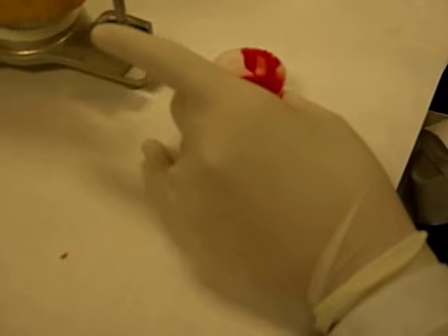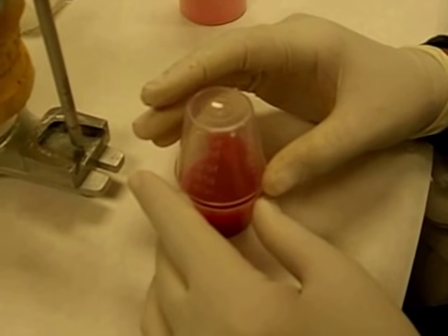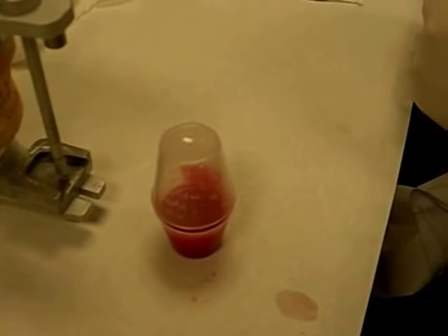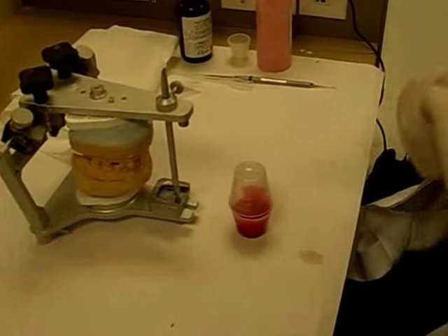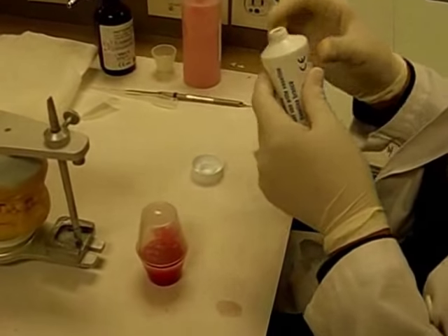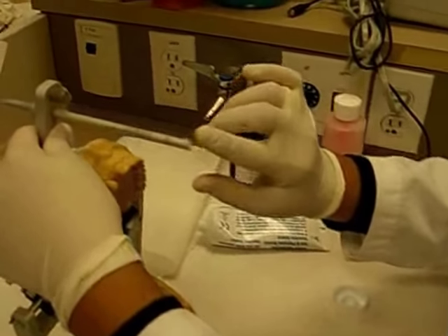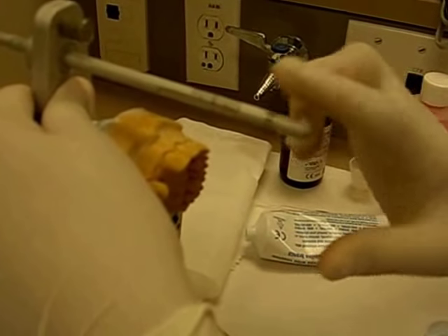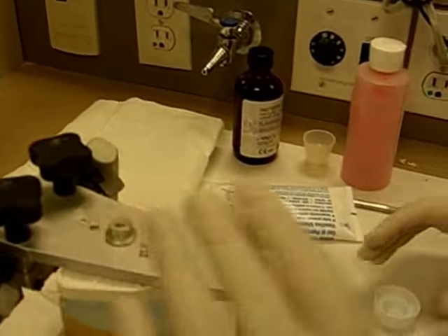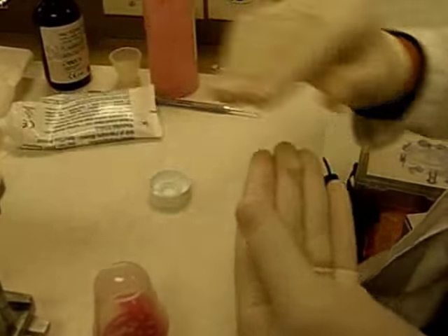After mixing, we want to put something over the mixture so we make sure the monomer doesn't evaporate on us. As I said before, I already put Vaseline on the table and I want to make sure the tip is isolated as well. It also helps to put some on your fingers.